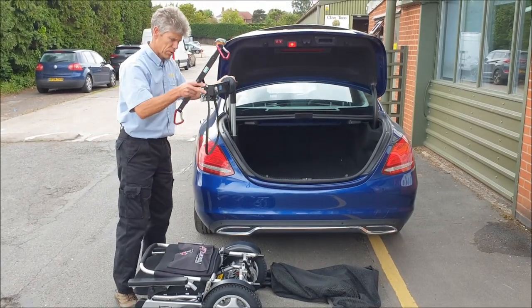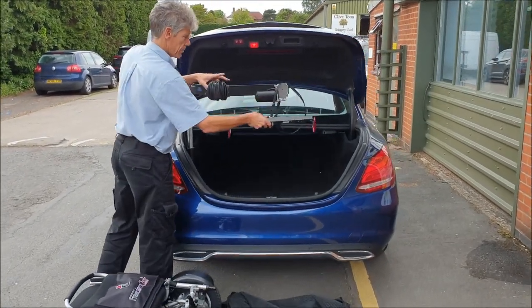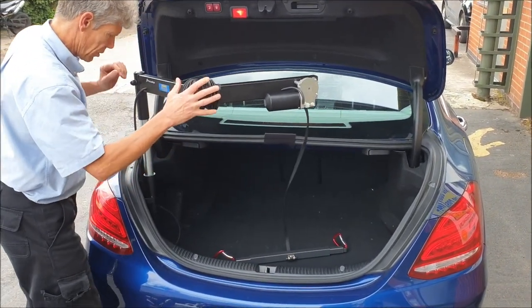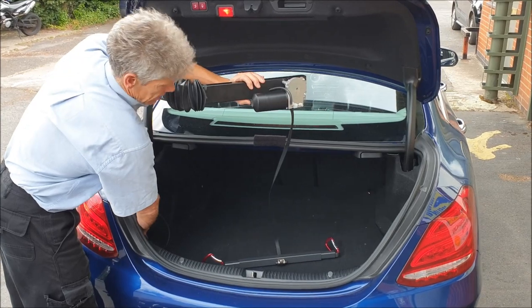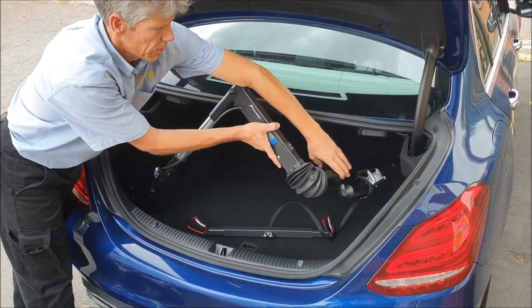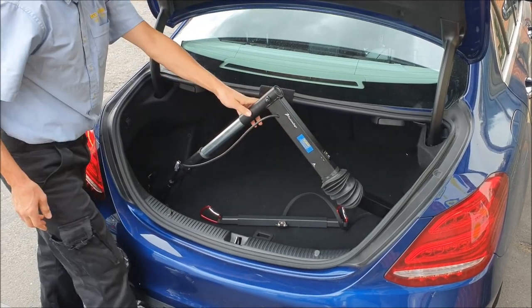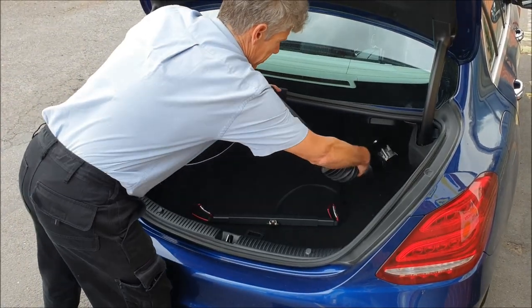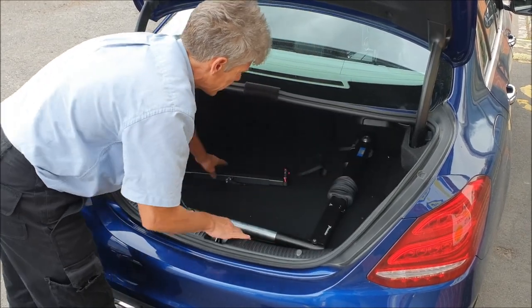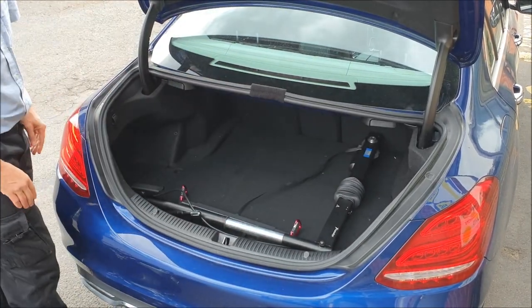If we're just going out on a trip we can fold that in — there it goes down. That folds down quite flat without the scooter there, so that's quite neat in the boot.